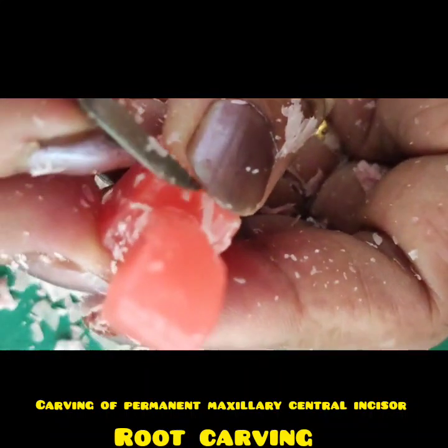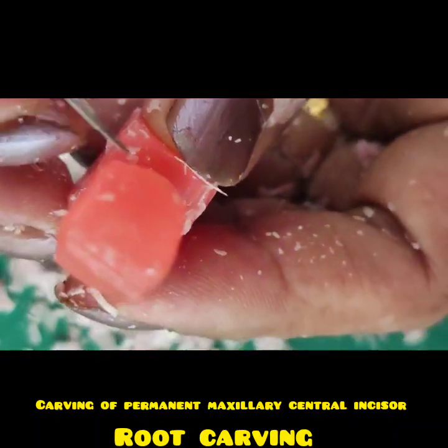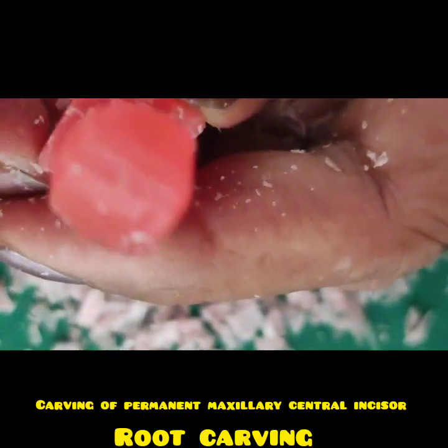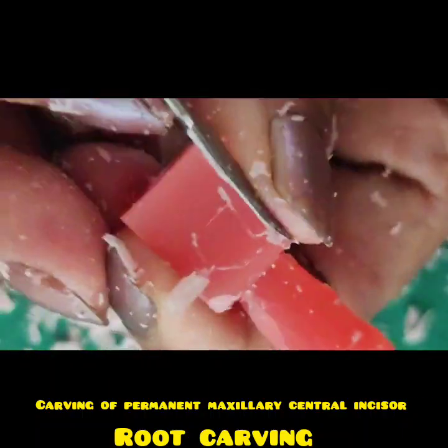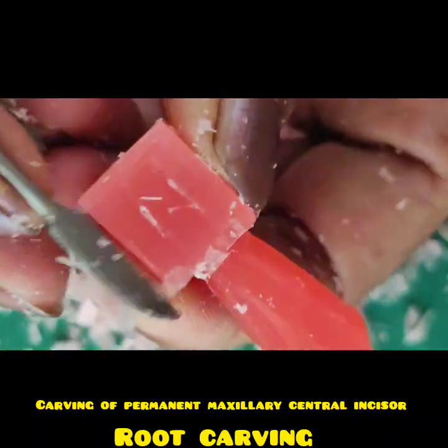So remove the extra wax on the top of the base, make it like a tabletop, and polish it.